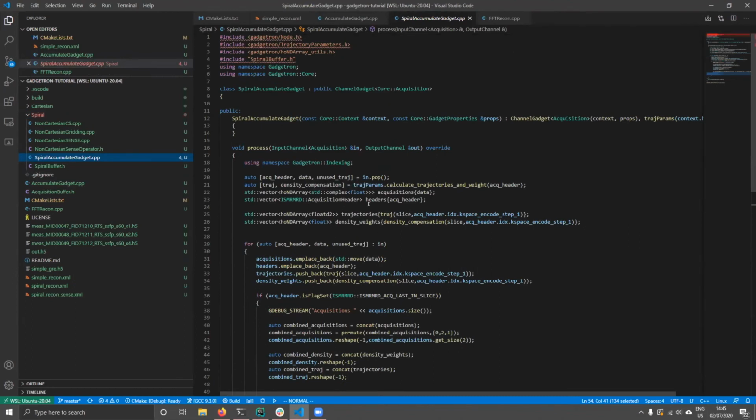A lot of things are going on, but let's take them from the top. The reason this is a spiral accumulate gadget is when we receive acquisitions, even though they could have a trajectory, they typically don't, even if they are non-Cartesian. Most scanners simply don't append them, but typically they will tell you in the header what sort of trajectory it is. So we need to calculate the trajectories. We need to calculate the density compensation. We want to append that to the acquisition, and we want to send that on in one package that's easy to reconstruct.